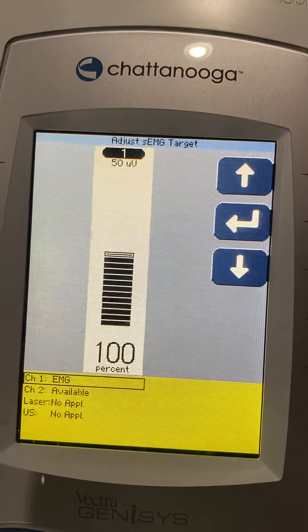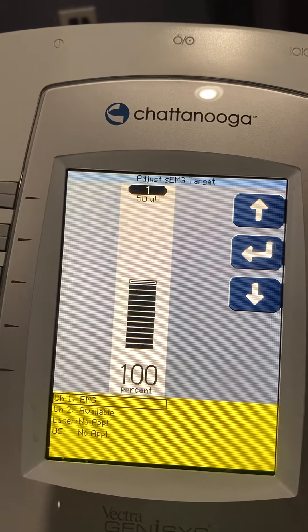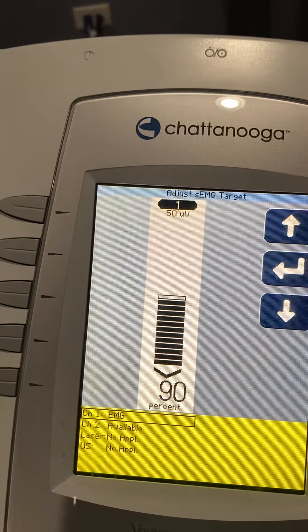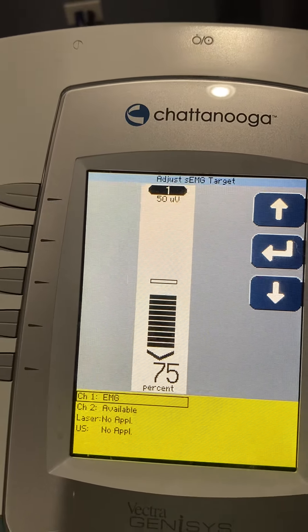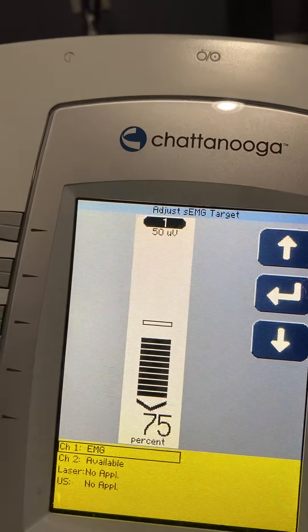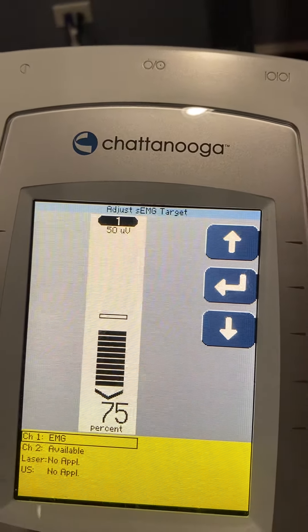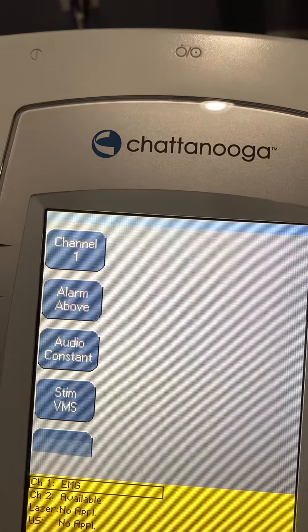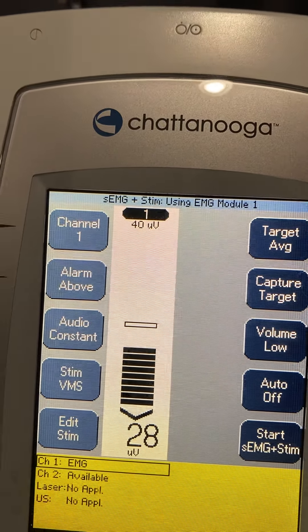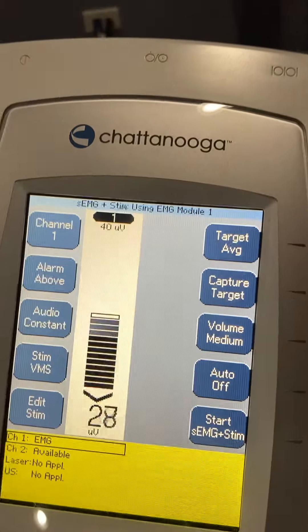If she's working as hard as she possibly can doing a full set of 10, I doubt she'll hit her max every single time. So I'll usually take the target down to about 75% of their average. This is where we set our threshold — the patient's target — representing how many fibers of this muscle we want to contract. I'll turn the volume back on.